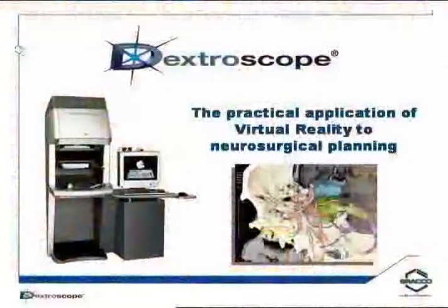I'm a director of marketing for Bracco, and we're bringing this product that you're about to see to market. And we hope to be able to show you some very interesting cases and some very interesting technology and true stereoscopic three-dimensional imaging. So let us get started.